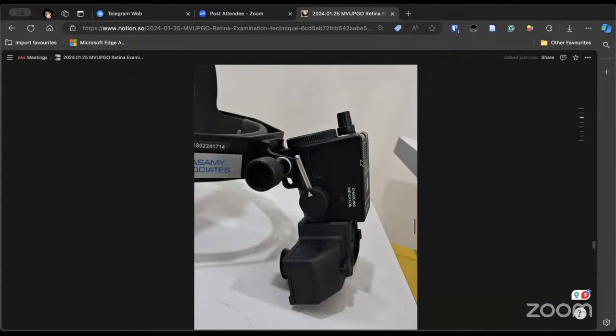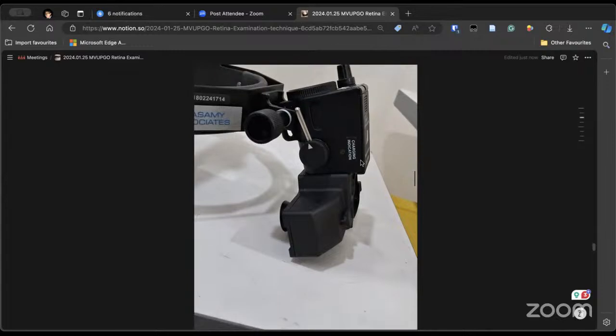Yes, I would prefer slit lamp. 90D with slit lamp, or 78D with slit lamp, will be the answer of choice. Do not say that you will use the direct ophthalmoscope. If you use it, you might be missing some fine or very minimal changes.